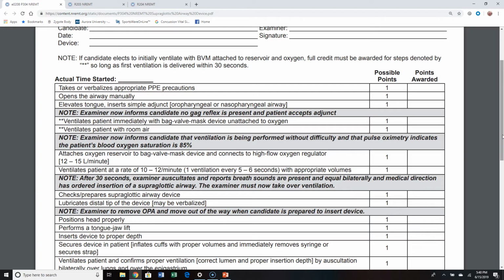The other metric, whether it's a non-rebreather mask or a bag valve mask, is that we never want to see the reservoir bag attached to that device decrease its volume by more than 2/3 per ventilation. In the bag valve mask, if I squeeze the bag and I see the reservoir almost completely empty, I need to increase my flow rate for my oxygen. Vice versa, if it's the non-rebreather mask, as we'll talk about a little bit later, if the patient takes a breath and the reservoir bag almost completely collapses, we need to increase the flow rate. That bag should never deplete by more than 2/3.